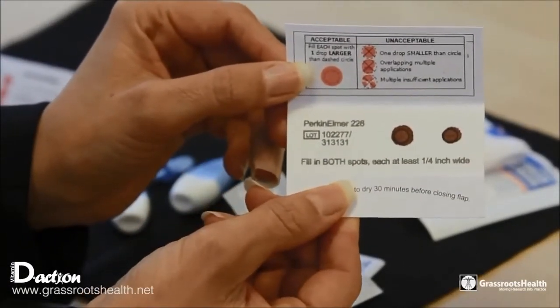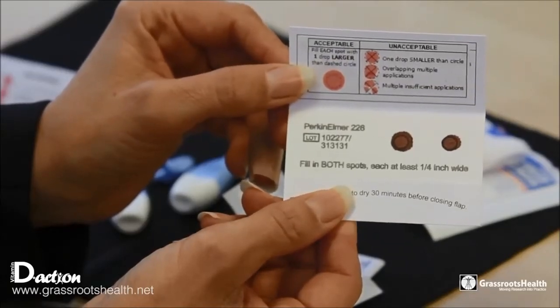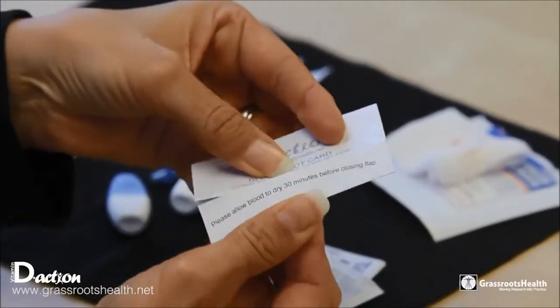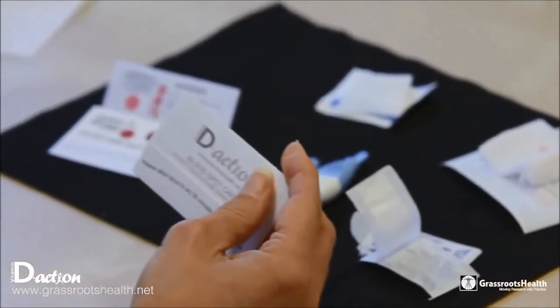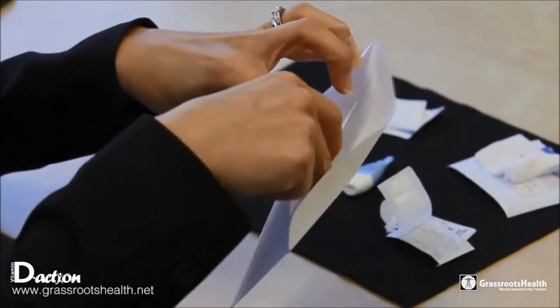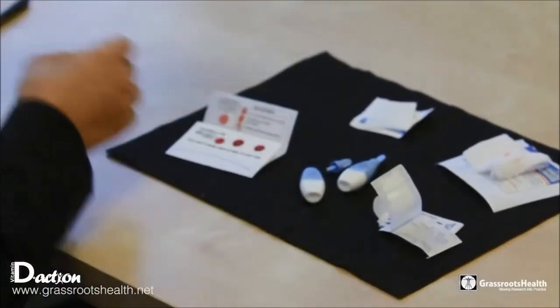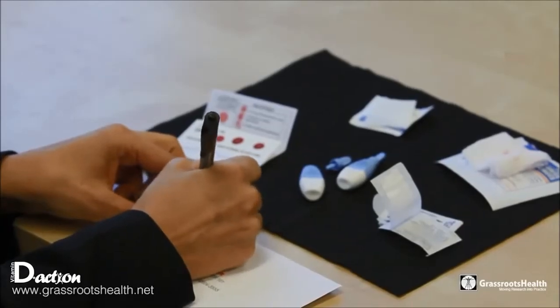Once you have dried your blood spot card, they should be slightly brown and look like this. All you need to do is close the top flap and tuck it in ever so slightly, put it in the envelope, make sure your return address and stamp are on it, and send it off. You will get your results within the next seven to ten days.